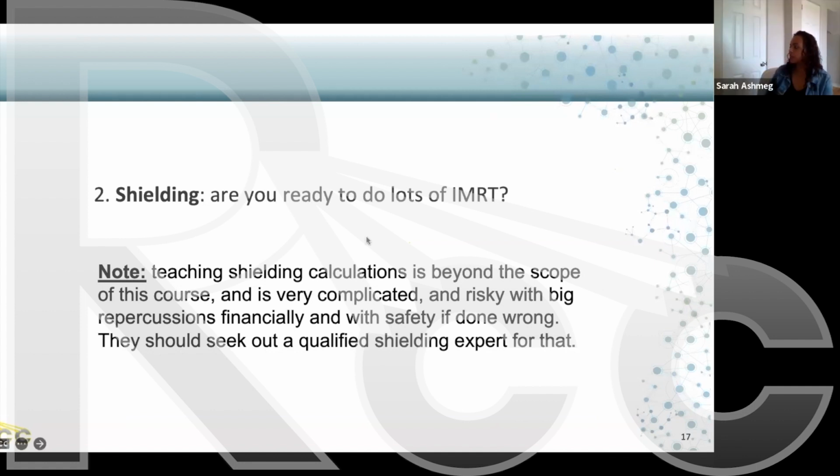Great, the question is regarding the control points. I think the question was, could you explain control points briefly? The meaning of control points. Yeah, and that is just a point in the plan with a certain MLC pattern. So a particular MLC pattern is called a control point.